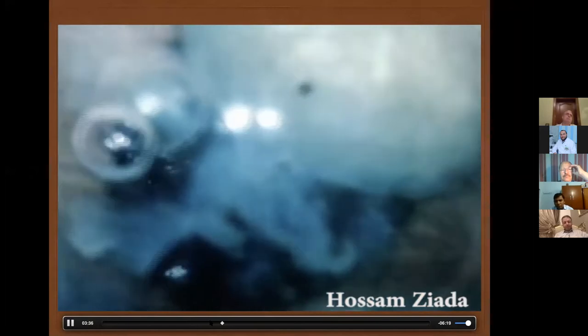And I'm sorry for the poor resolution, because this is recorded from the LCD of the OR in our university hospital, when one of my colleagues got a capsular tear while the other half was still inside the eye. So I picked it up in the anterior chamber and implanted a one piece, because the three piece was not available at that time. So I implanted the IOL down the nucleus and above the anterior capsule. So the nucleus is now supported by this IOL, and I am no more scared of dropping.